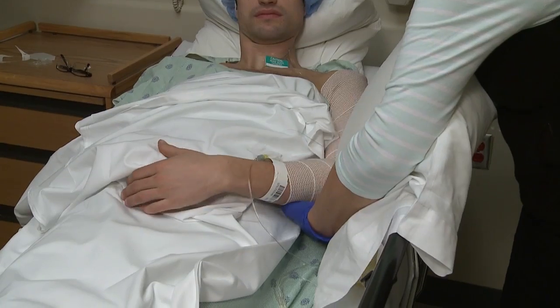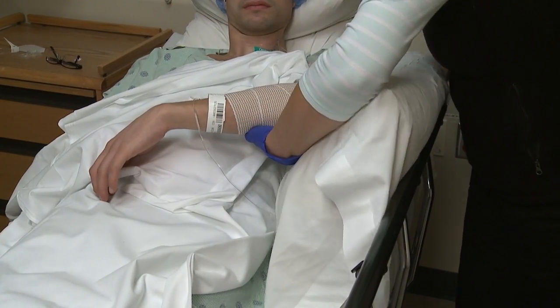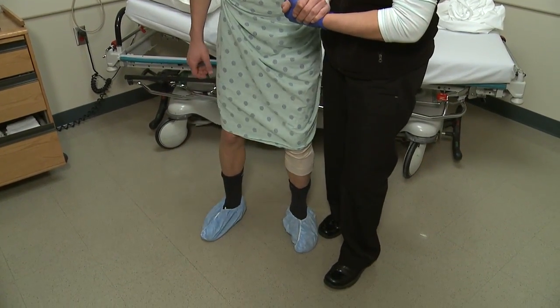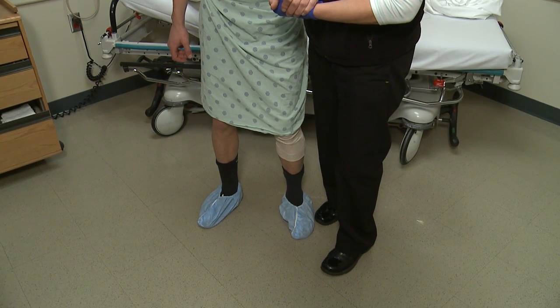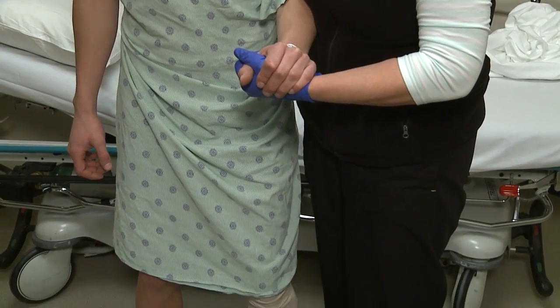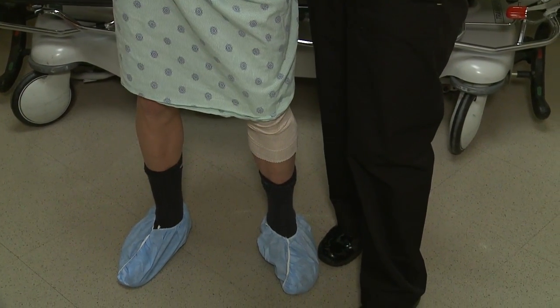Remember, be careful with your limb while it is numb. You may not feel it if you pinch it in something, or if you put something too hot or too cold on it. If it's your leg, don't try to bear weight on it alone, because you may fall. Even if you feel that it is not causing you weakness, just having surgery on your leg can make you unsteady on that limb for a while. So have someone assist you when you stand on it to ensure that you don't fall.